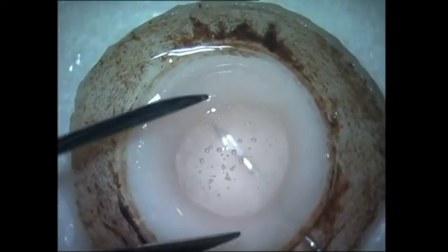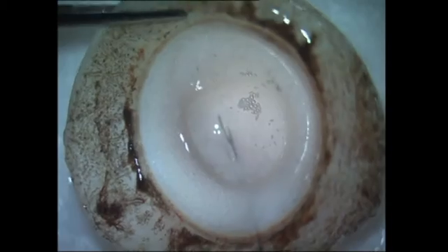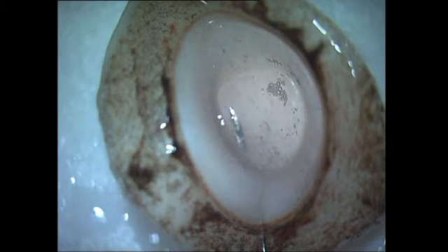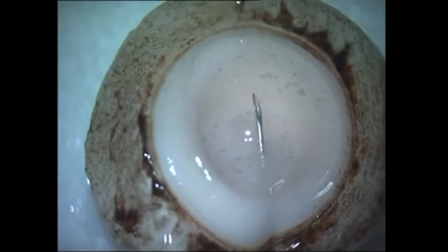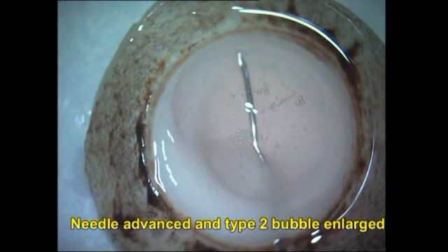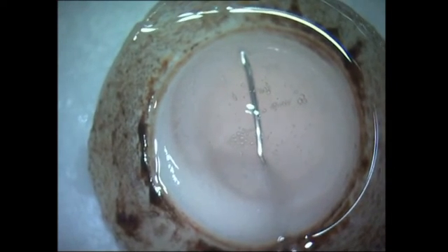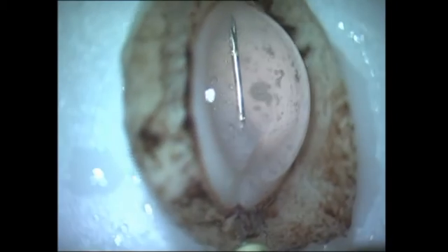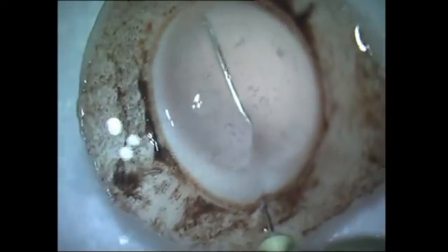This would result in a split graft if I cut it at this point, which would make surgery very difficult. So what I do is advance the needle edge beyond the extent of the type 1 big bubble into the area where only the type 2 is present, and I continue to inject medium to expand just the type 2 big bubble preferentially. It's almost fully expanded except a small area at 12 o'clock, so I inject just a little more storage medium slowly and carefully to expand that terminal undissected bit as well.